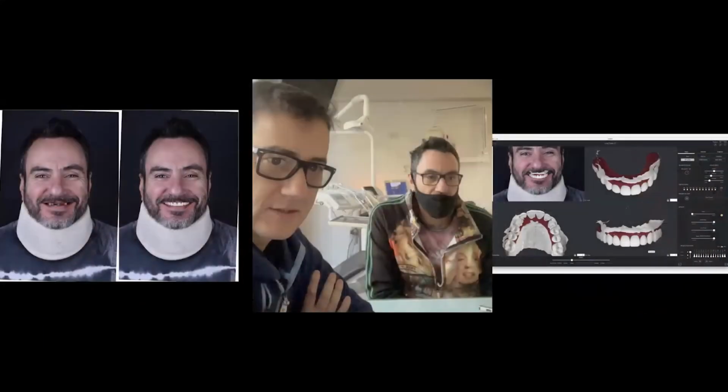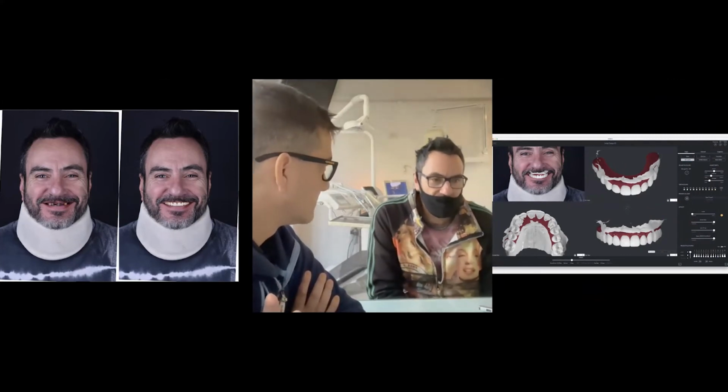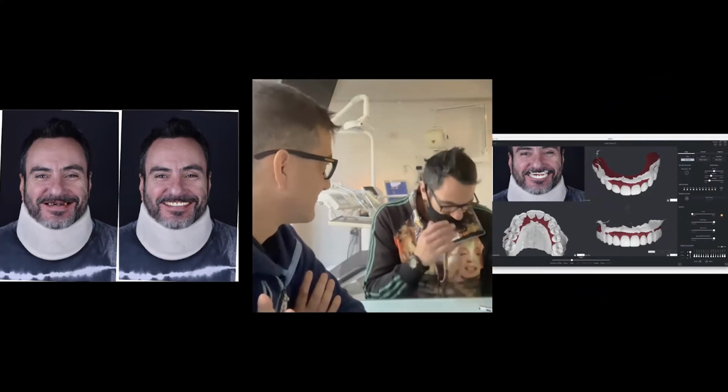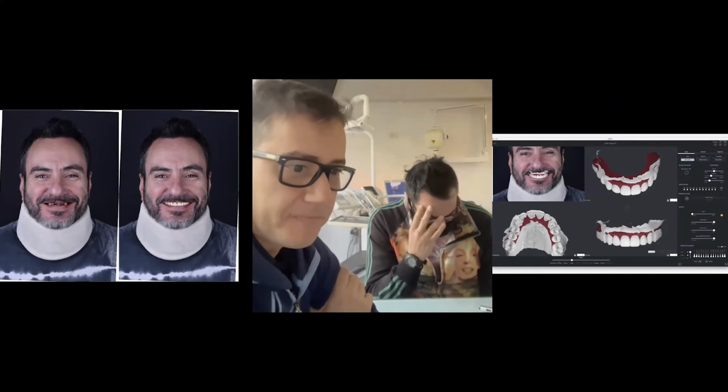Then this is the work. Just to show you, Ralph, this is the first impression of Marcelo in the interview. He looks for the first time at how we will look.